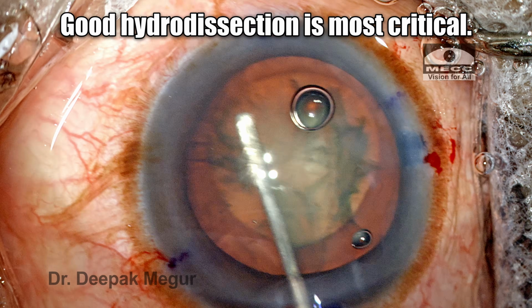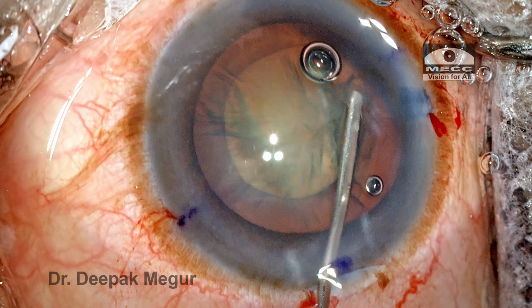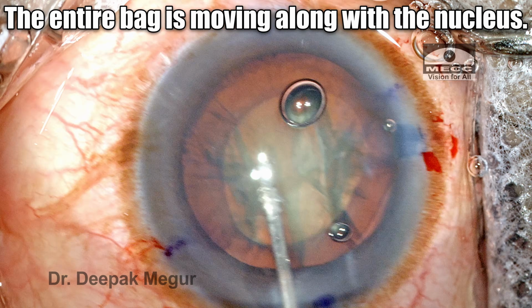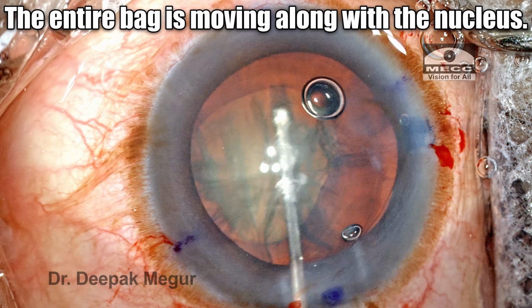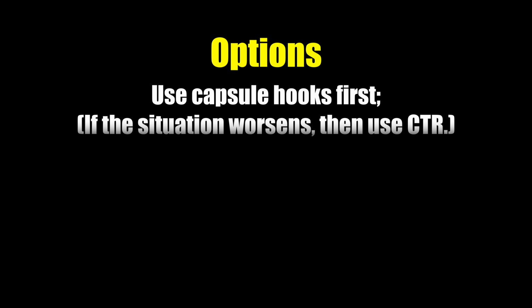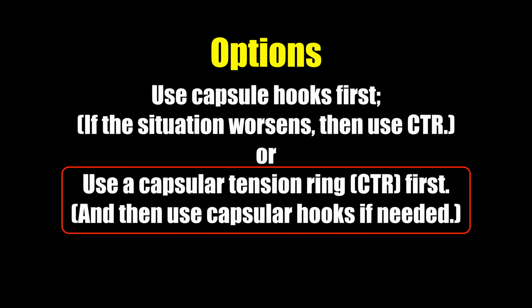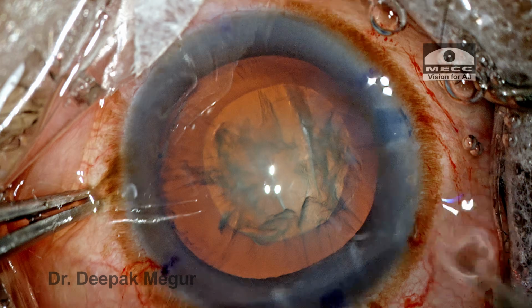Hydrodissection is probably the most important step here because I cannot proceed further unless and until the corticocapsular adhesions are broken. A gentle rotation attempt is sufficient to tell me that the hydrodissection was not effective and we need to stabilize the bag. So what do I do next? My usual options would be to use the capsule hooks or the CTR. Which one to go first? Usually I go with the CTR, but in this case, looking at the enormity of the zonular weakness, I thought I will go with the capsule hooks first instead.